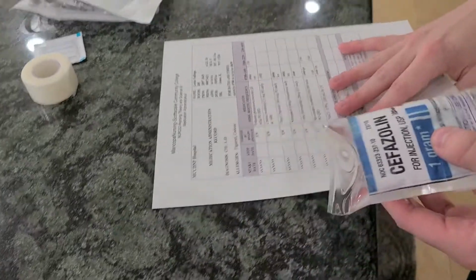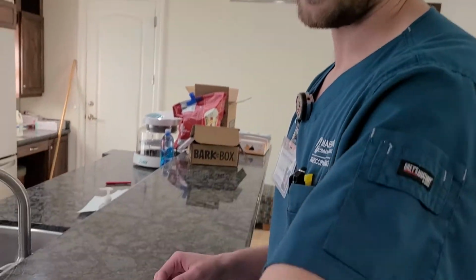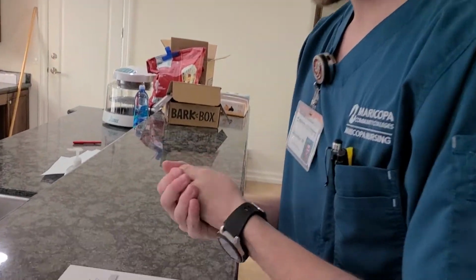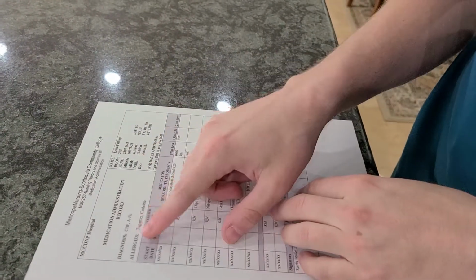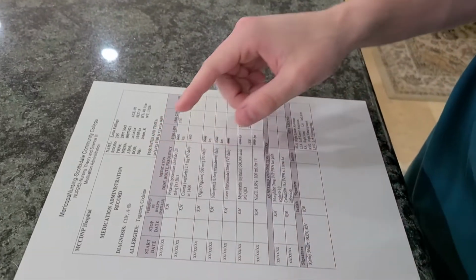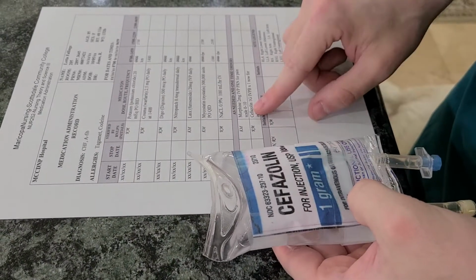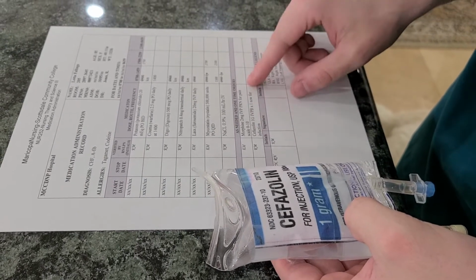Now I'm going to go over to my nurse's station to do my second check. Again, I'm going to wash my hands. I have patient Lotta Fallings, date of birth 10/5XX with allergies of Tagamet and codeine. We have our medication here, cefazolin 1 gram, which was ordered as cefazolin 1 gram IV piggyback times 1 now for infection at 0800 hours.